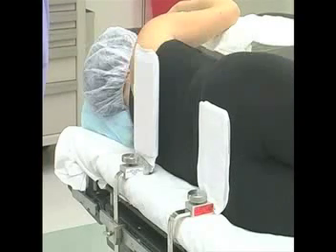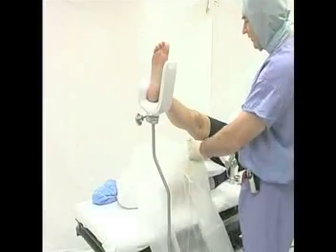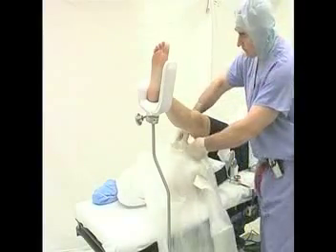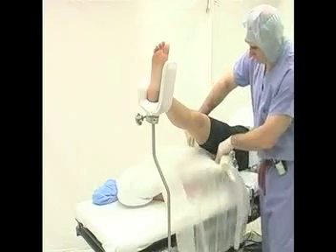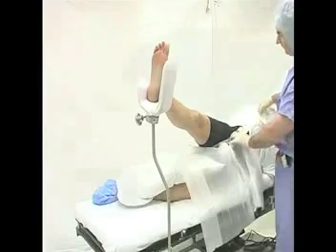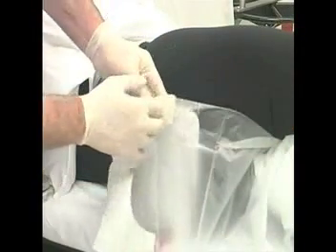Check the pelvis to make sure it is in the position desired by the surgeon and make adjustments as needed. There may be a difference in the width of the chest to the pelvis — many women have a relatively wider pelvis resulting in tilting of the pelvis in the coronal plane. Place support such as folded blankets under the chest until the spine is parallel to the operating table. This generally will correct the coronal malposition of the pelvis in wide-hipped patients.